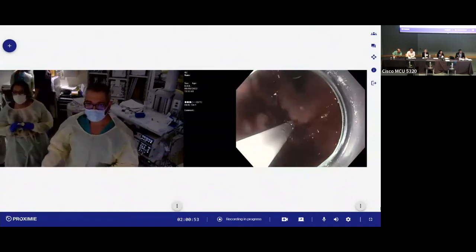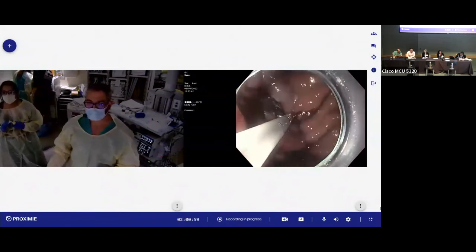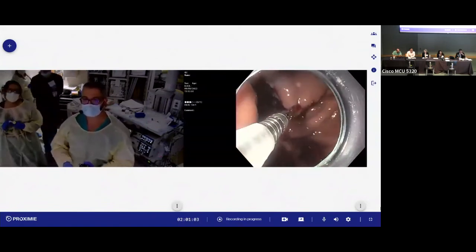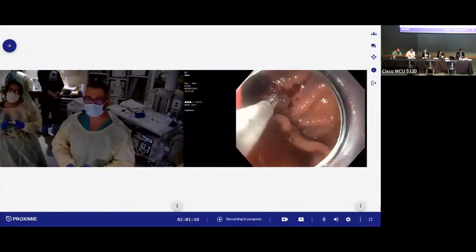Mohammed, this clip requires a therapeutic channel. Did you change your scope to a 1T scope? Yeah, we are using a 1T scope now. Let's open the silver side. So yes, I forgot to mention that if you're using Olympus, close now. Deploy.